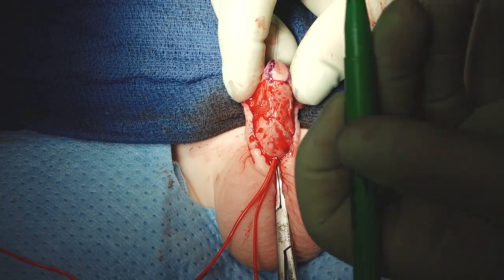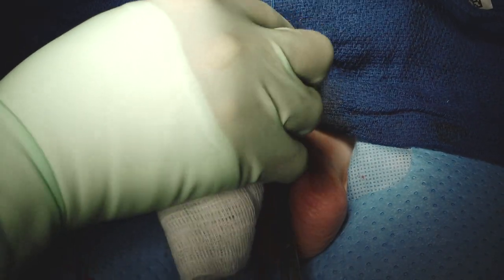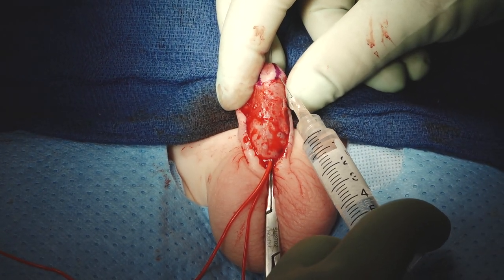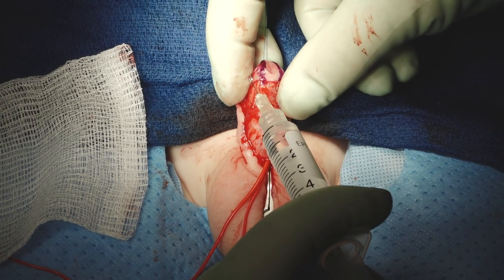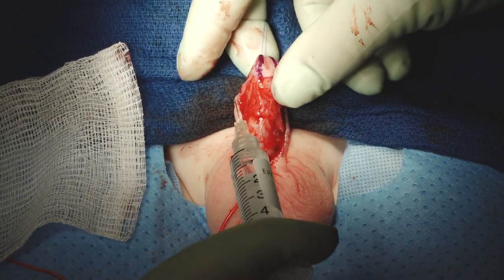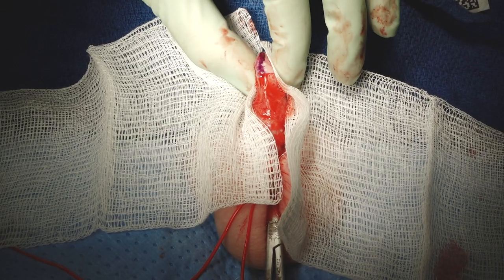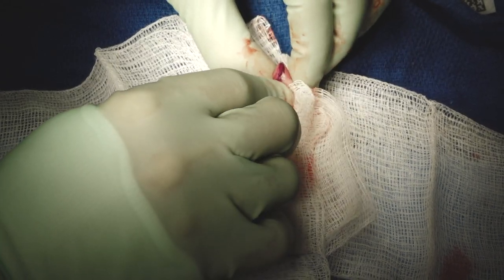Now we have a tourniquet on and we're going to inject some epinephrine too. There are a lot of superstitions about tourniquets and epinephrine, so we just use both. The key — we've said this in every film we've made — the surgeon has to see the anatomy clearly. Sometimes the tourniquet alone isn't enough, and sometimes the injection alone isn't enough, so we use both and we see better.